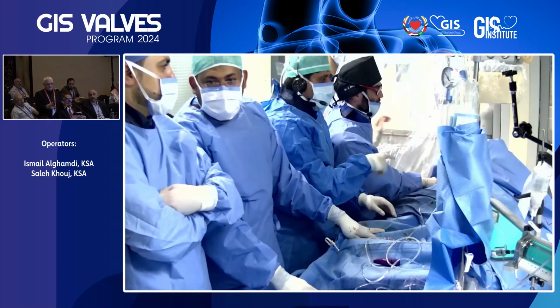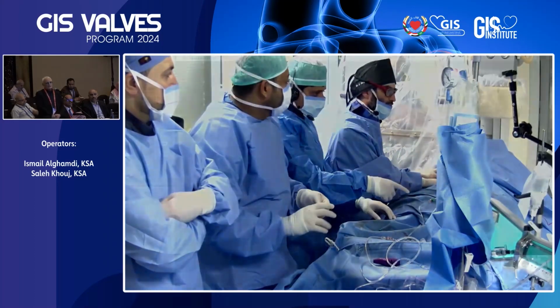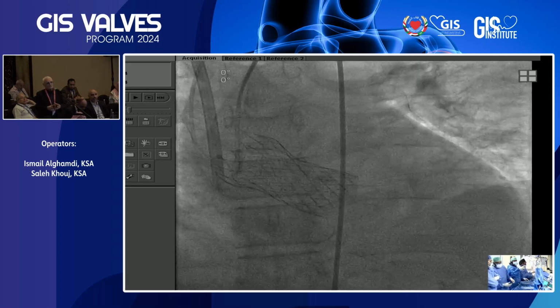You don't dilate that particular raphe, you don't break the raphe. You could even argue whether you create room for the valve. So why not use the balloon once it's there to see whether a 20 seals, and then you can even downsize a little bit more. Just a few comments.